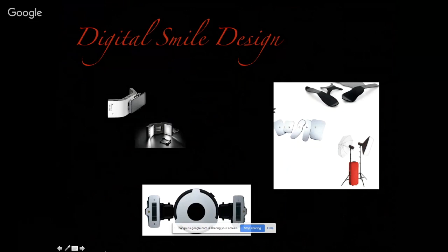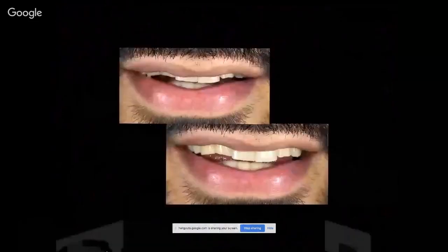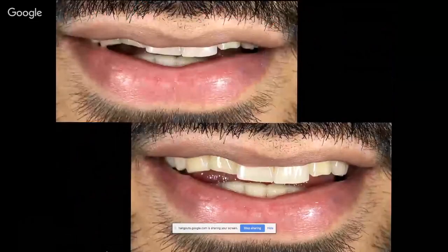The MDP device was invented by a friend of mine, and I think you know him, Dr. Luis Hardan. And the photos you're going to see during this webinar are done exclusively with this device. So this patient came to our practice. He's a 25-year-old male, complaining about the coverage of the upper lip on the upper jaw, and about wear on the laterals and canines.